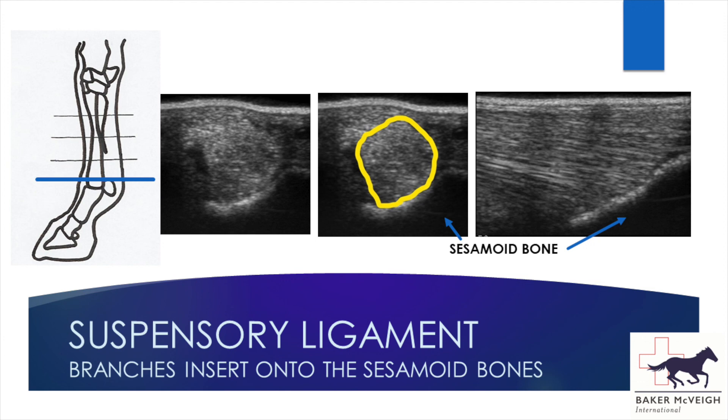So that's a brief run through the normal leg. I hope that's helpful, and there'll be a second part covering pathology.